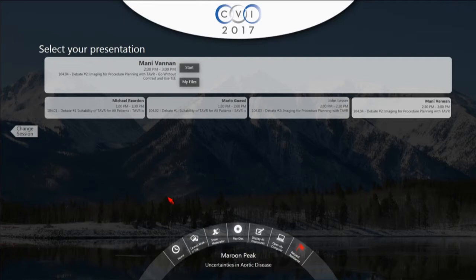CT is a little bit better in terms of manual method reproduction, but even for CT, I say, why don't you use an automated one? And if there is an automated software available, which it's available for CT, but they seem to be reluctant to apply that. But to Mike's point, all you need is a volume data from 3D TE, and if you can run the software on the machine, you can do this either in your office offline, using the 3D TE data, or you can do it intraprocedurally. It takes a few seconds to do this from the time you acquire the data.